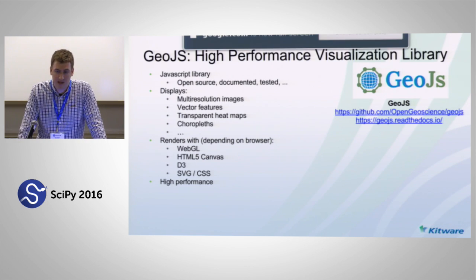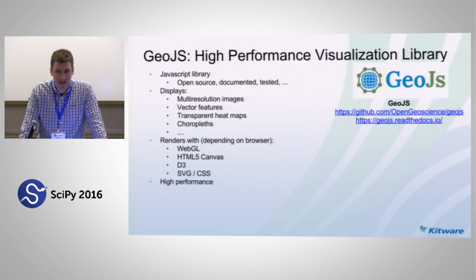We also are using, as another thing I'd like to mention, GeoJS. If you're familiar with the geospatial domain, there are a number of viewers out there for large 2D surface imagery, OpenLayers, OpenSeadragon. We have GeoJS here at Kitware because we found that the existing ones didn't provide a good mix of low-level access to WebGL primitives that's necessary if you want to do really high performance, but also good software process that were properly tested and documented and extensible.